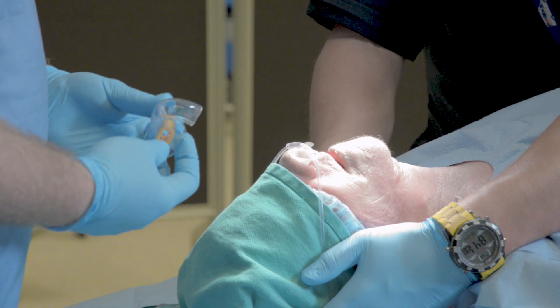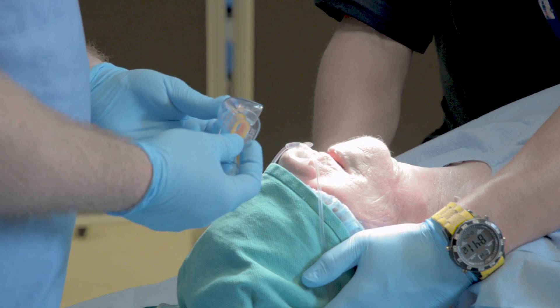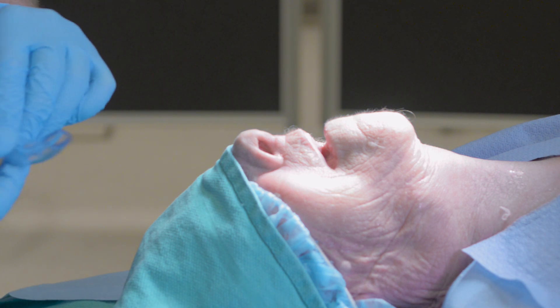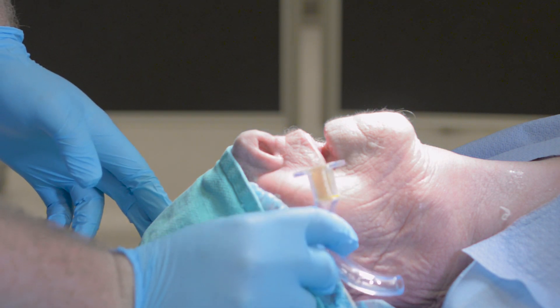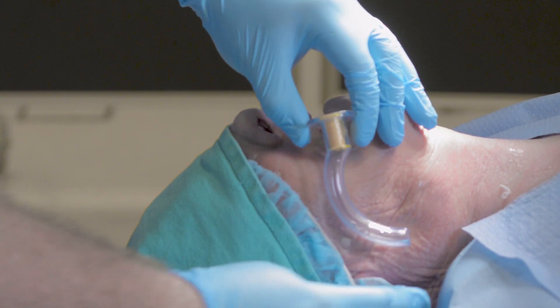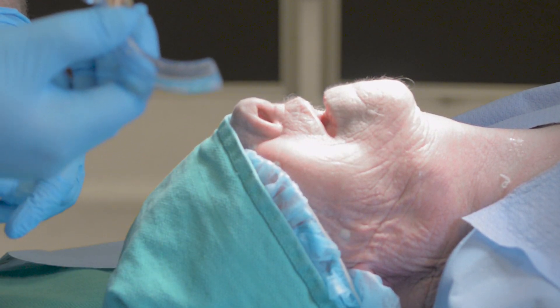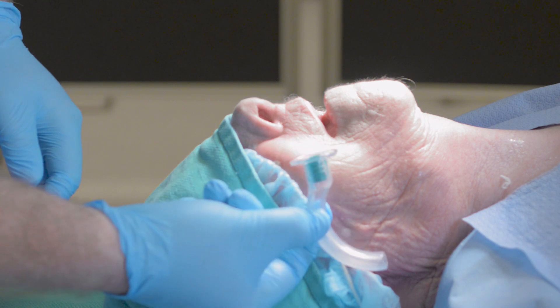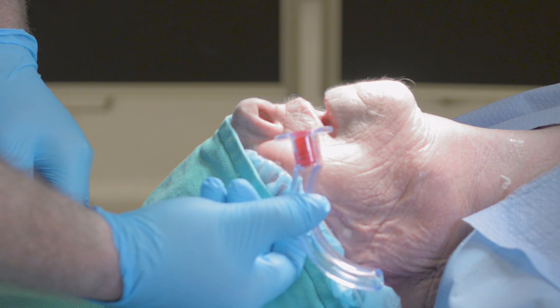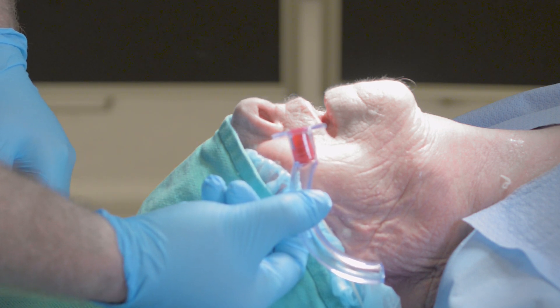Additionally, we can manage soft tissue obstruction with an oral pharyngeal airway sized appropriately for the patient. Sizing for an oral pharyngeal airway is estimated by holding the device up to the patient's face, measuring from the corner of the mouth to the tragus of the ear. Sizing is important — a device too small will be ineffective, while a device too large may cause soft tissue obstruction by pushing the epiglottis over the patient's airway and obstructing the vocal cords.